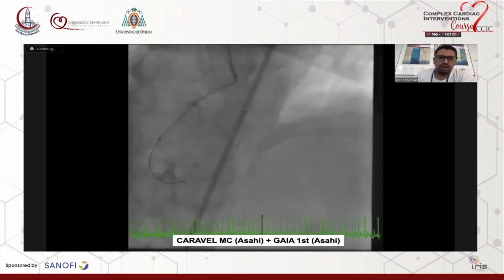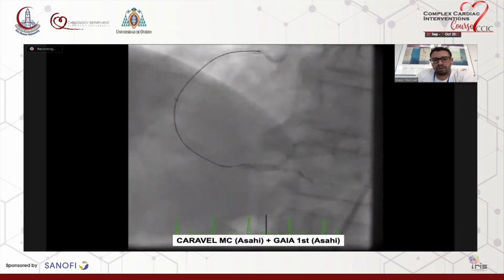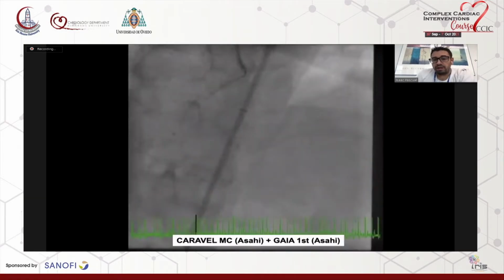in order to progress with the navigation in the body of the occlusion with good feelings, but not absolutely sure of being in the true lumen or subintimal. So we check it properly, and we think that we were going subintimal.